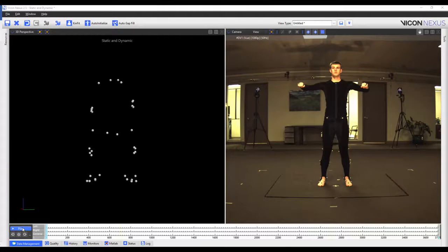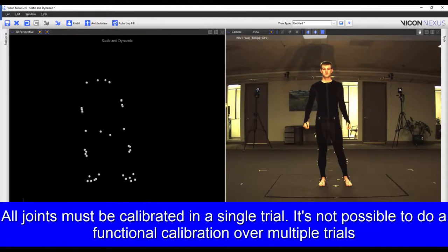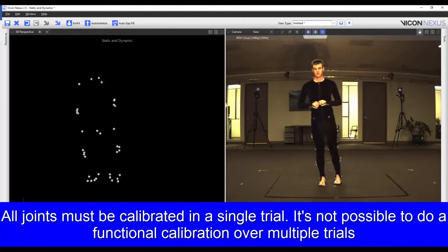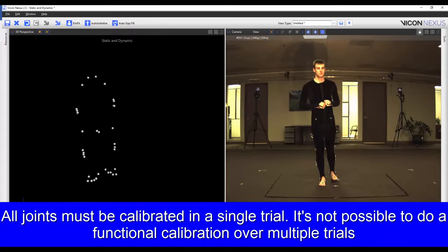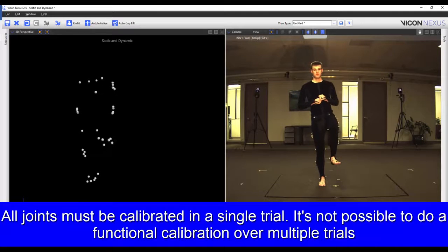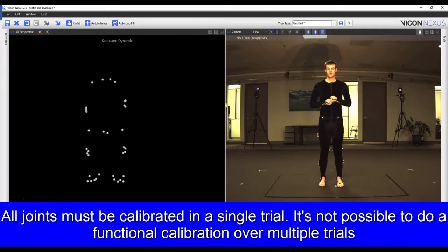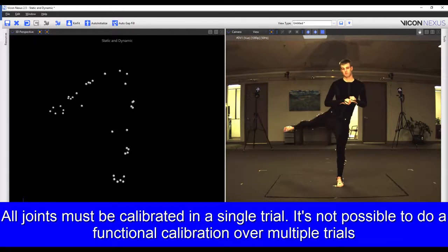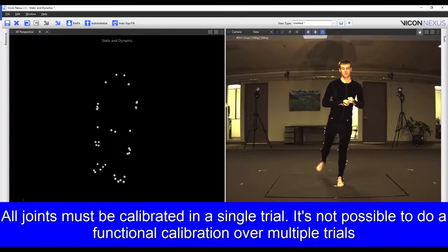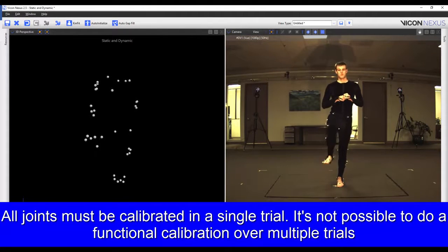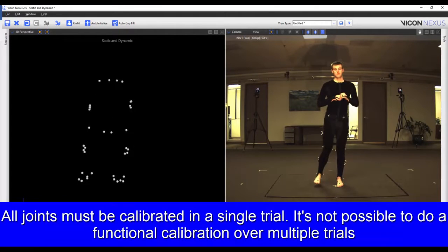I've captured a calibration trial where my subject is first standing in the base pose. Then he moves through a range of motion where he's performing a star pattern with the hips. He flexes and extends the knees and rotates the ankle joints. He repeats the process on the other leg. Finally, he returns to the base pose.